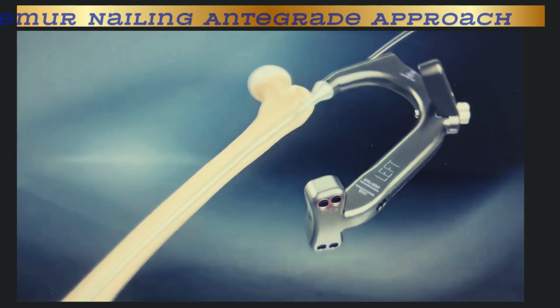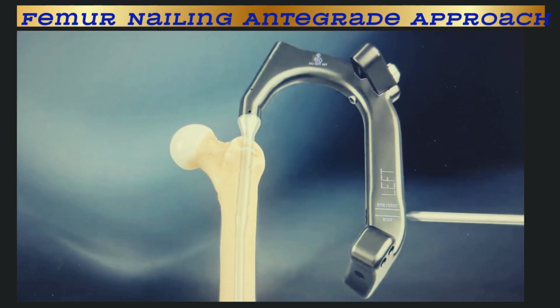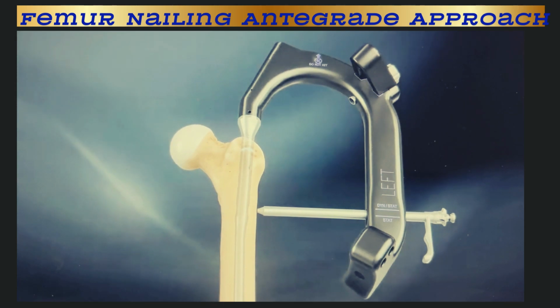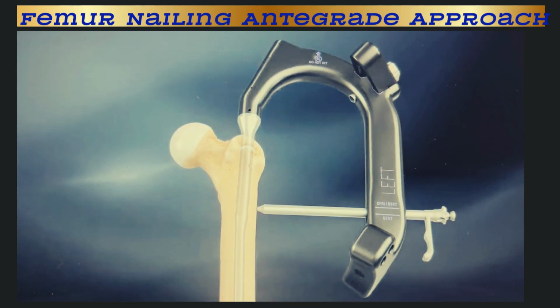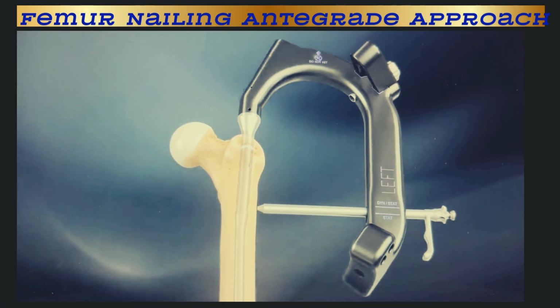Remove the ball nose guide wire and place the screw sheath, 4 mm drill guide, and 4 mm obturator through the appropriate transverse hole in the targeting guide and mark the skin. Make a small incision and place the sheath, drill guide, and obturator through the incision into the lateral cortex.